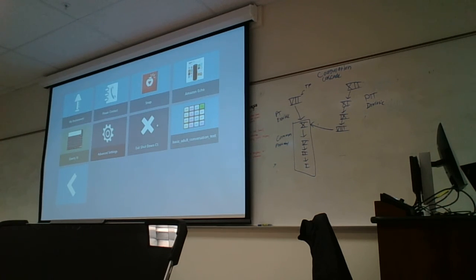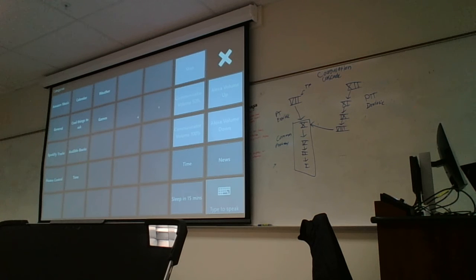Another area within Communicator 5 that a lot of clients have asked about, and it's also within Snap Core First, are some pre-programmed pages for things like Amazon Echo or Google. So a lot of clients that we come across now, they do have smart homes, or they have something at home that they could use. So this device gets picked up just as your voice would be, so you can create commands so that they can communicate with something like an Alexa.